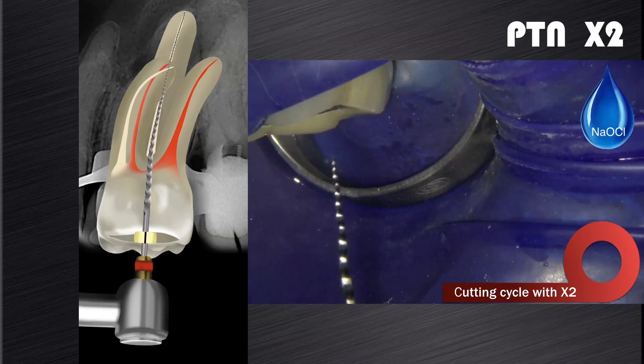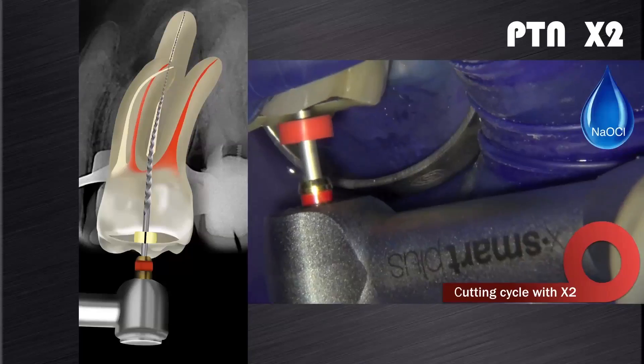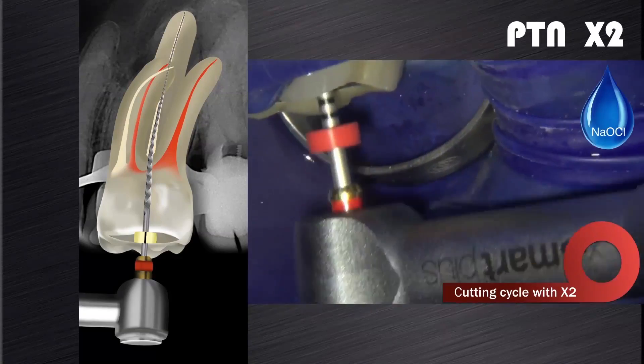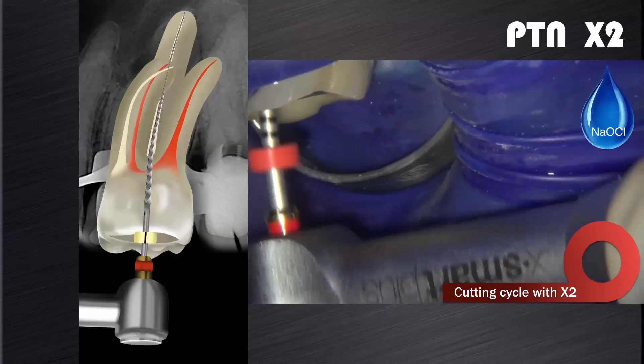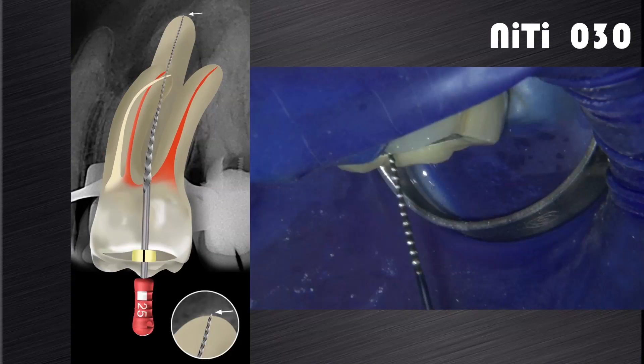Now we introduce the X2, the 2506 instrument, in the presence of sodium hypochlorite. The X2 is used in a brushing motion to free up coronal space, allowing the file to progress further down the root canal. If it fails to progress, remove the instrument, clean the flutes, and irrigate before proceeding with another cutting cycle. After preparation with the X2, the foramen is gauged with a size 25 NiTi hand file. If the file fits snug at length, the canal is shaped and ready for disinfection.